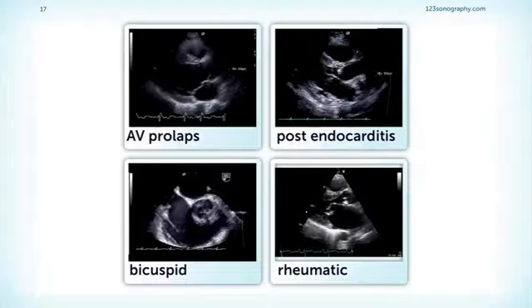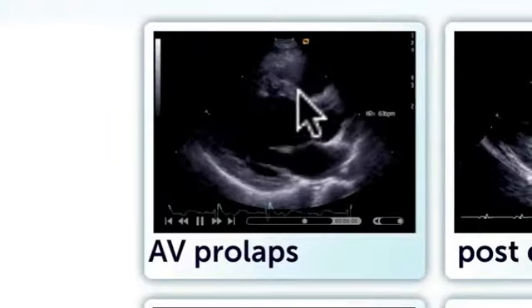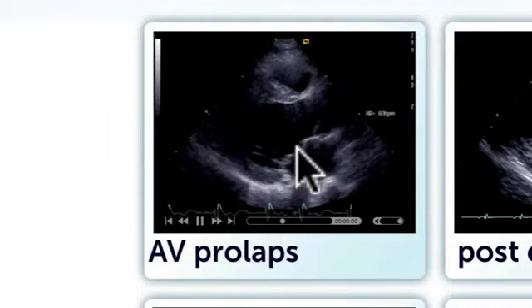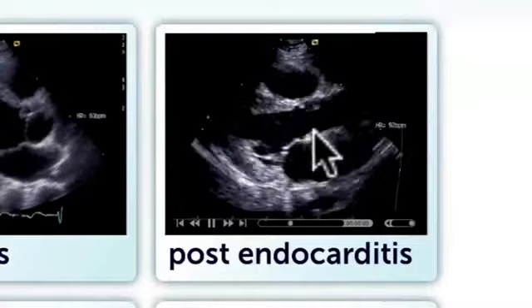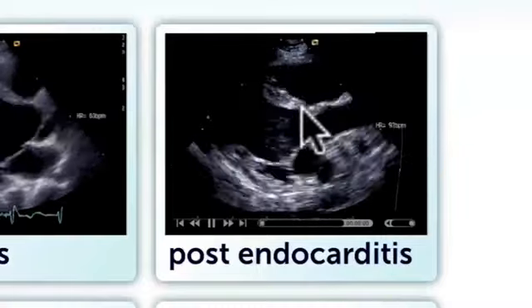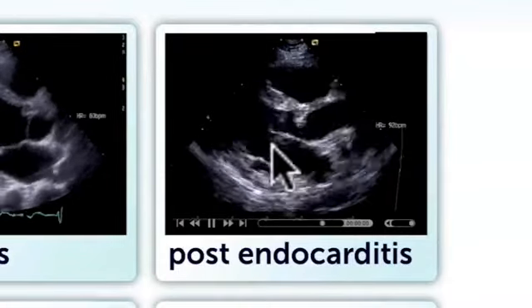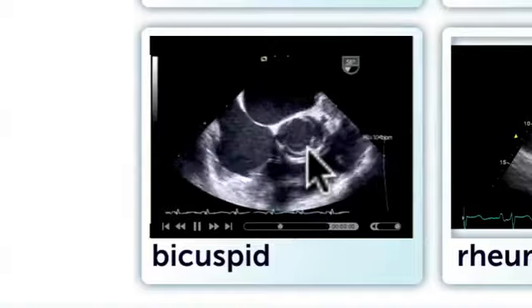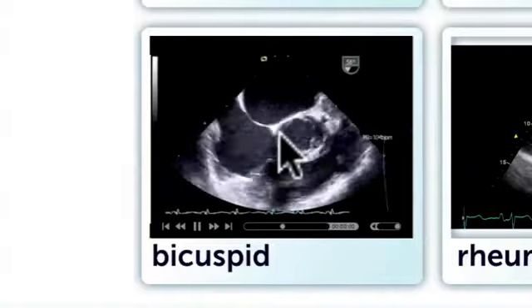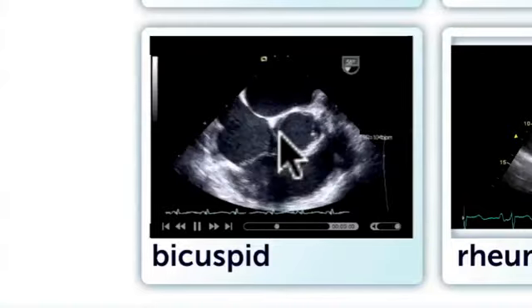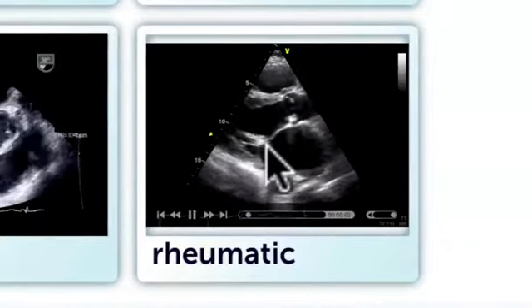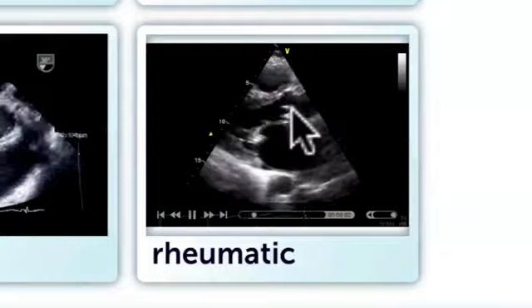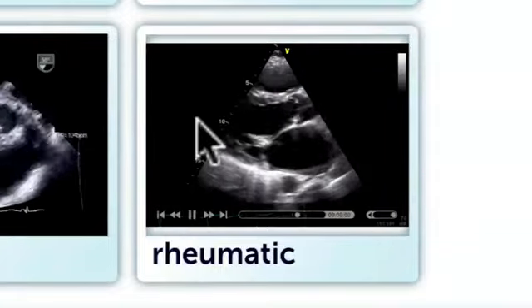Several causes of aortic regurgitation can be illustrated. A patient with prolapse of the right coronary cusp often has an eccentric jet directed toward the anterior mitral valve leaflet. A patient with prior endocarditis shows residual vegetation and thickening of the right coronary cusp causing valve destruction and regurgitation. A bicuspid valve patient with two cusps commonly has regurgitation. A patient with rheumatic heart disease shows doming and thickening of the aortic valve leading to regurgitation.